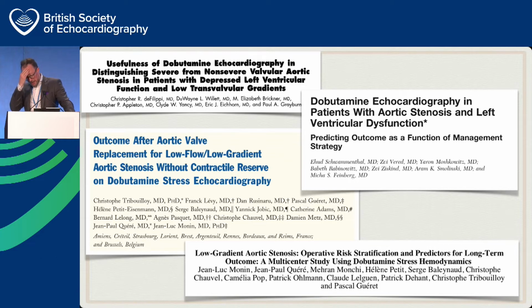And so we've been doing this for about 40 odd years, something along those lines. The top left is the first guide to describe it in the literature. They did it on about 8 patients, and then subsequently there's been these databases, you know, reproducing the technique, looking at outcomes, helping guide how we treat patients.